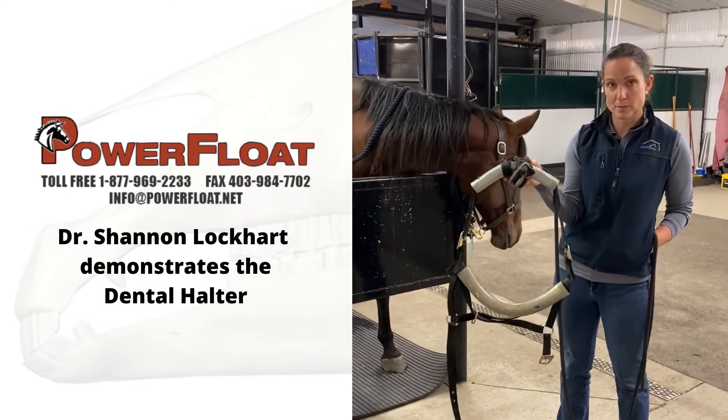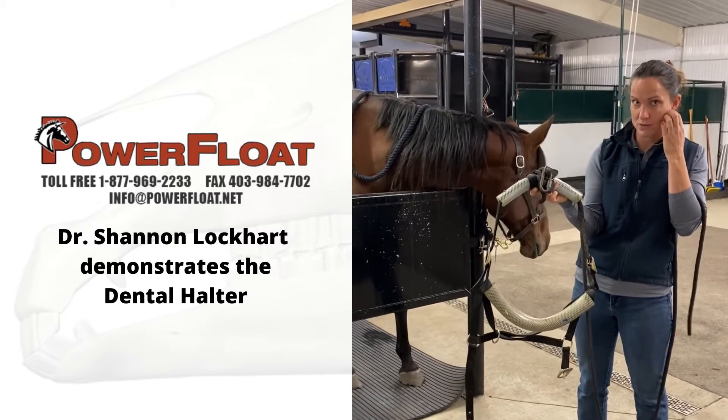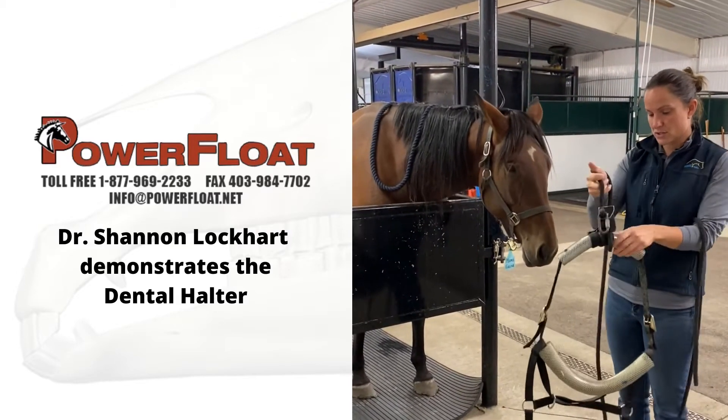Hi everyone, this is our PowerFloat Dental Halter. I'm just going to do a little bit of a demo on how I use it in my practice. So this is our dental halter.